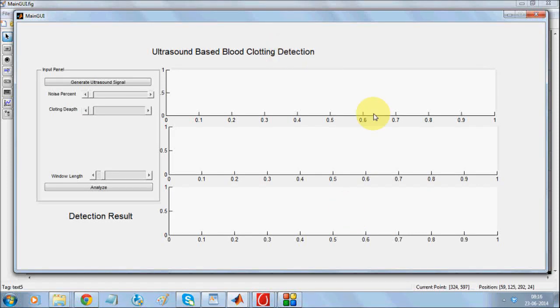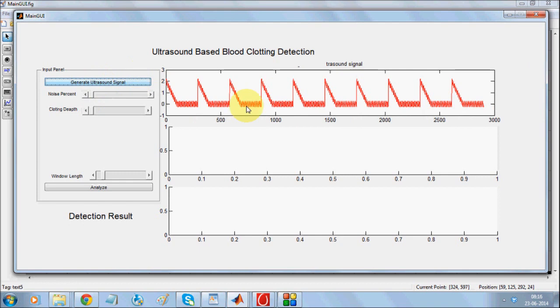Hello. This is a demonstration of MATLAB simulation of ultrasound-based blood clotting detection. At the beginning we will be generating an ultrasound signal. When you do an ultrasonic scan of the area where there is blood clotting, the signal will be something similar to this.